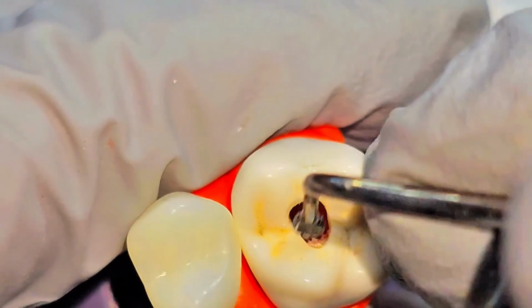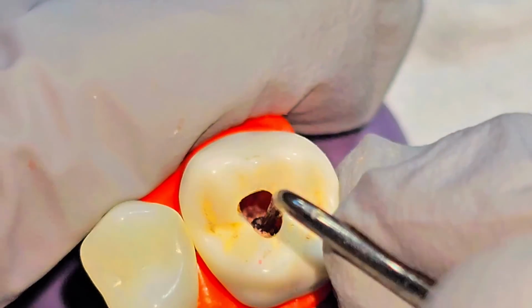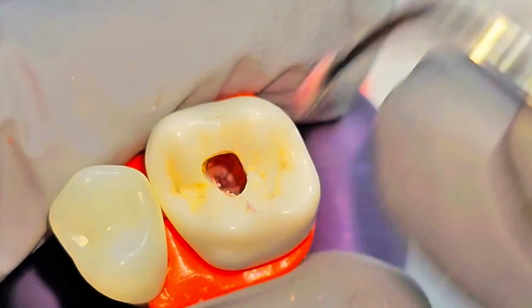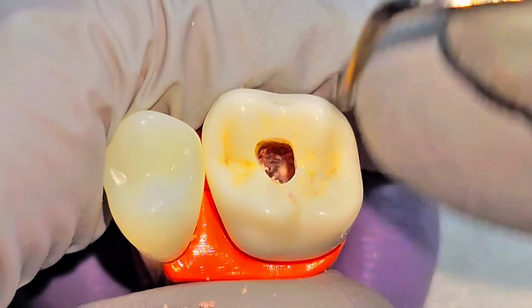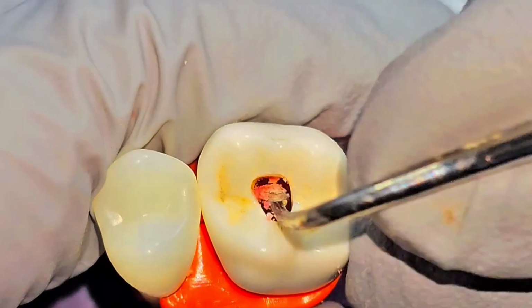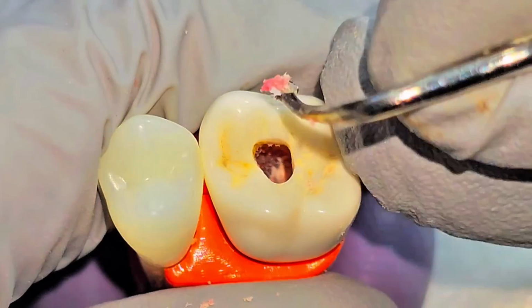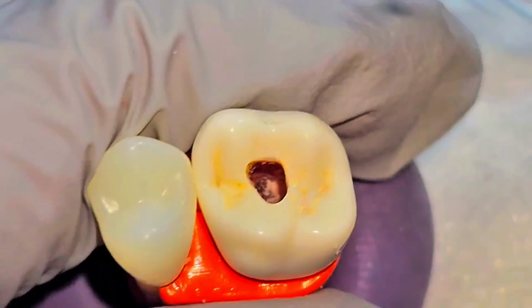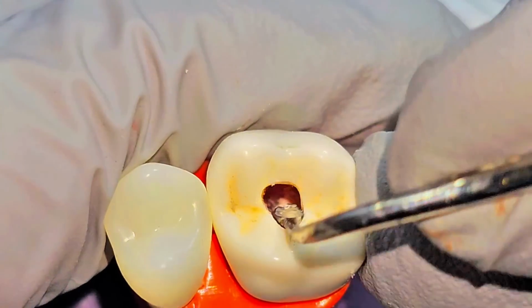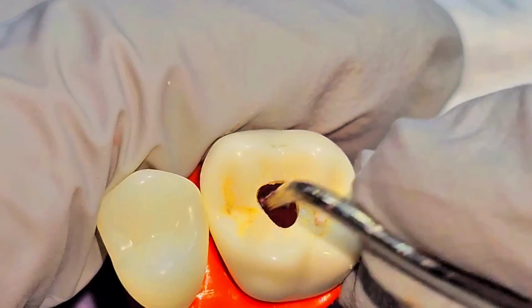But with ADEX, we can only use things that are allowed in the clinic. So, it feels like digging earwax. Yeah, pretty good. Good.